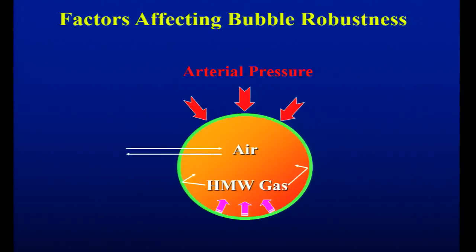So in concept, this microbubble has traditionally been air, but people have worked in the field with a lot of investment of time and money over, I would say, close to 25 years to try to develop tiny microbubbles that will cross the pulmonary circulation. So they have to be, as you would think, smaller than your 10 microns, and usually, as you will see, they're about maybe 1 to 3 microns.